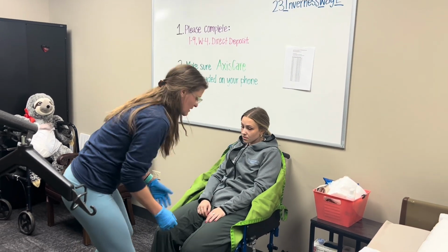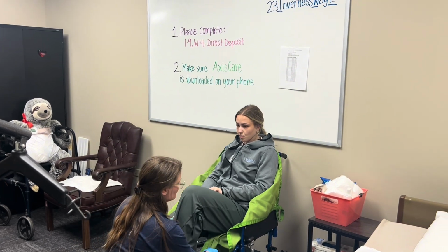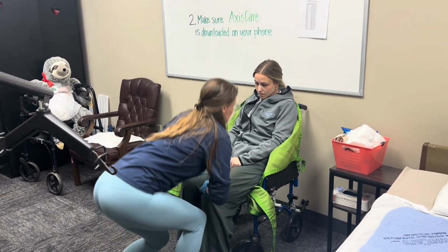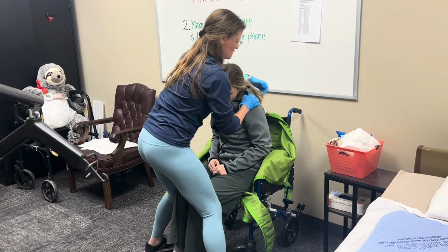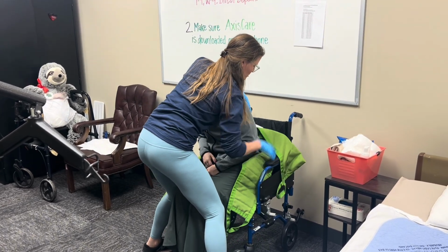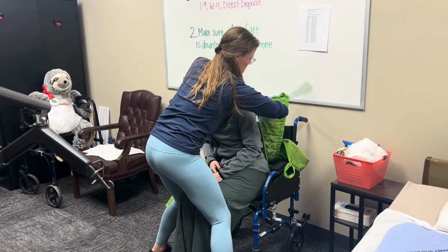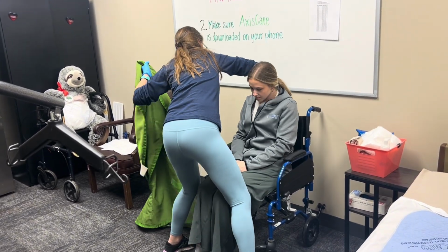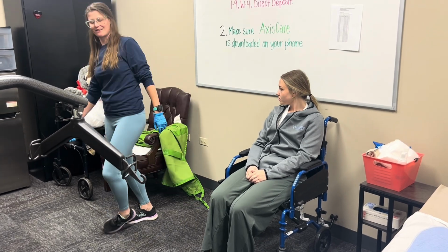So what I do is I lift both legs. So we're going to lift this leg and get this sling out. We're going to lift this leg and get this sling out. What I'd like to do then is lean forward and then get this out from underneath. And then we're going to lean onto this side and get this one underneath. And that is removing a Hoyer sling.